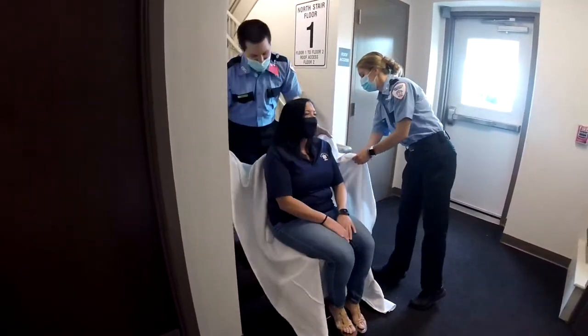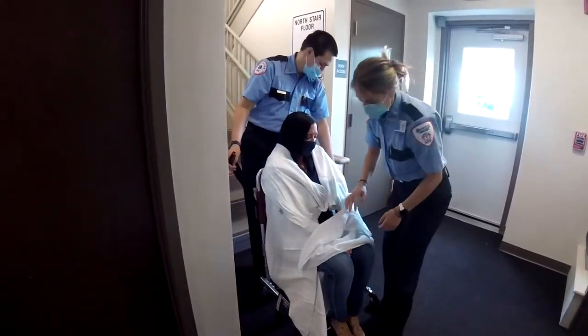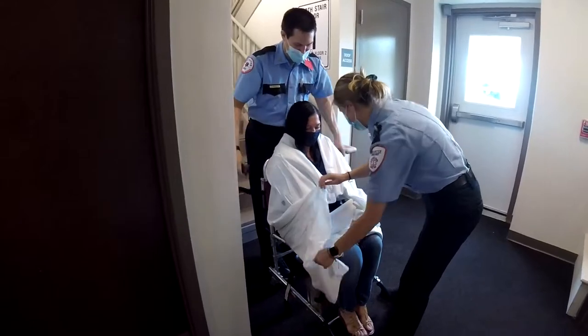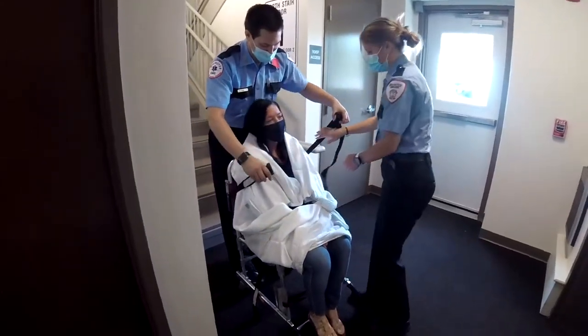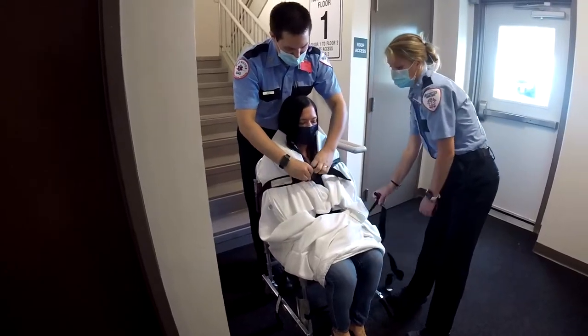Once the patient is properly seated in the stair chair, wrap them in the blanket to prevent their arms from reaching out and to provide further comfort. Please explain to them in detail the entire process they are going through in order to keep them calm.